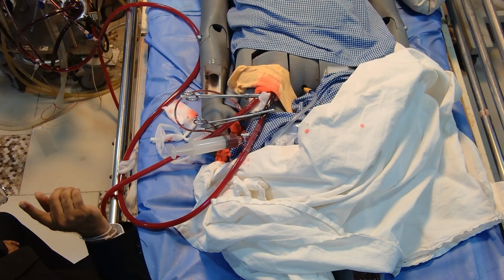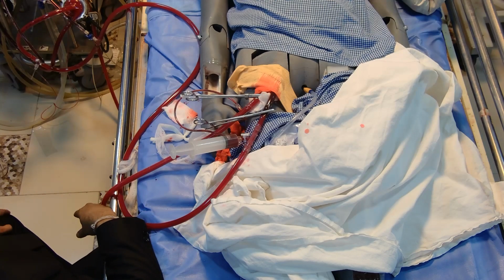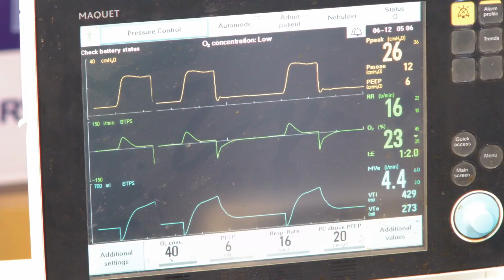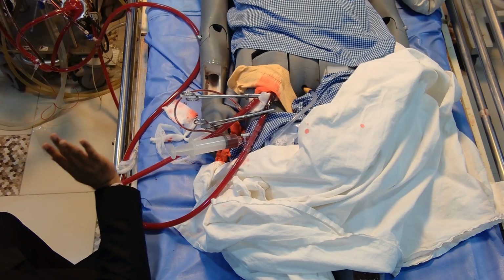Okay. Now, when we give a trial, there is a high tendency to clot formation. So, in that case, you have to increase your target ACT to around 200 to 220. That should be your target ACT at that time. And you have to monitor ACT both of the patient as well as of the circuit, because the patient is now going to be separated from the circuit. So, both patient ACT and the circuit ACT are to be monitored.